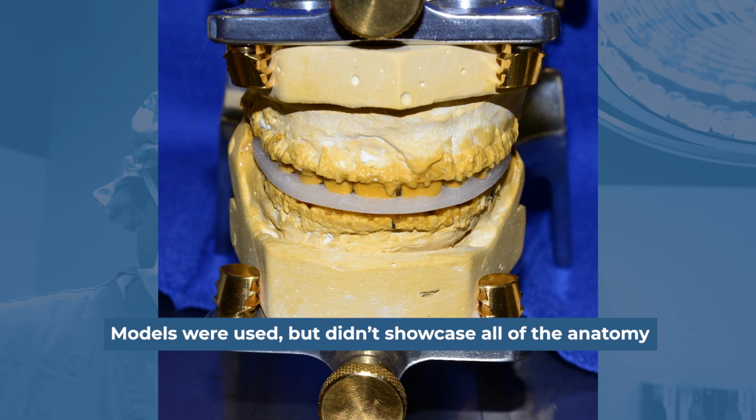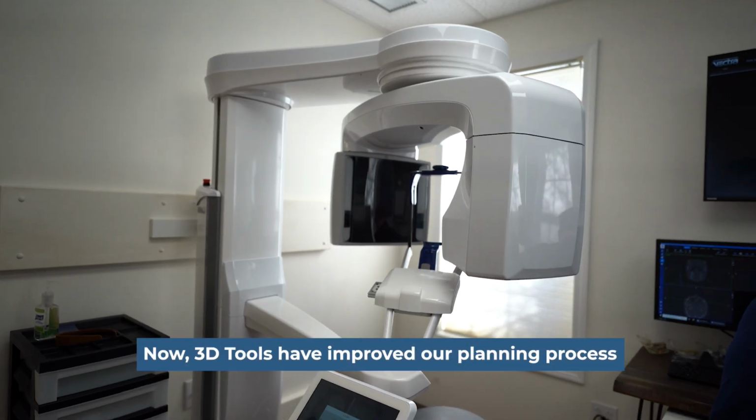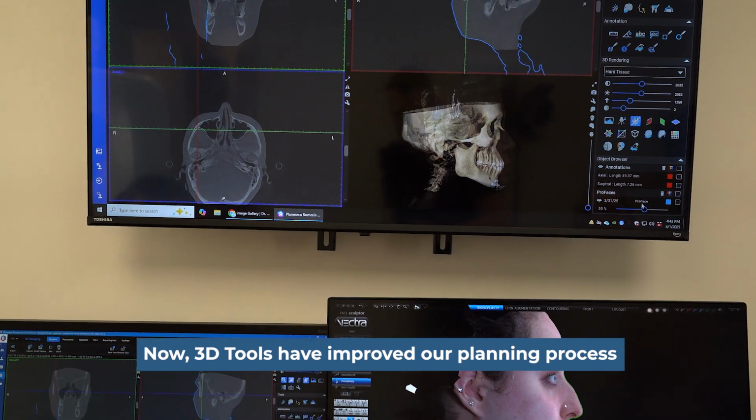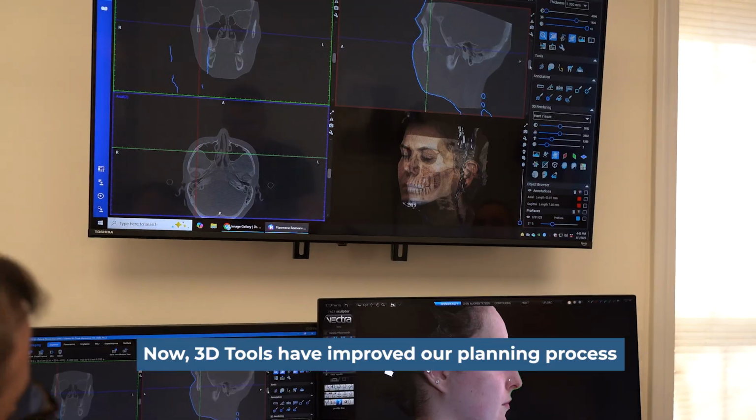However, those models had no indication at all of where the bone is, where the bone's located, where the airway is, what the septum looks like, where the tongue is, or really any of the anatomy that ultimately we care about. So with these 3D tools that we have now, the occlusion is important, and that's the first step, but it's kind of the base level of planning.